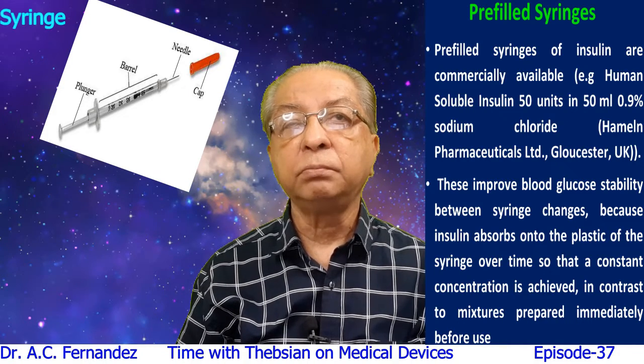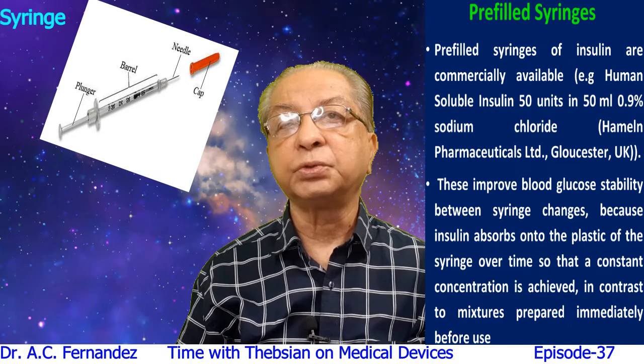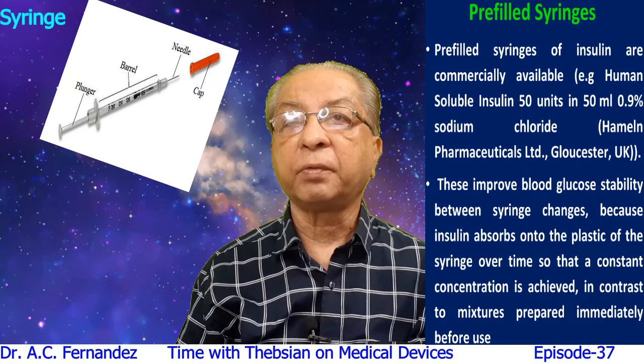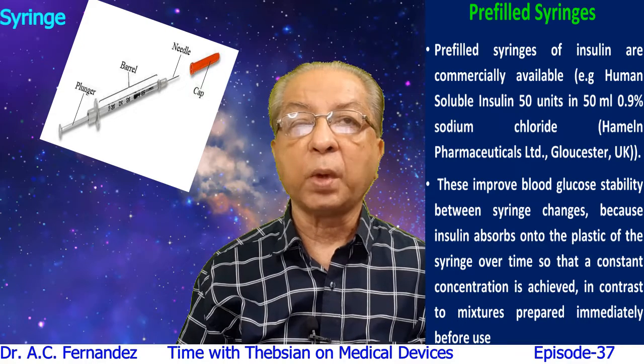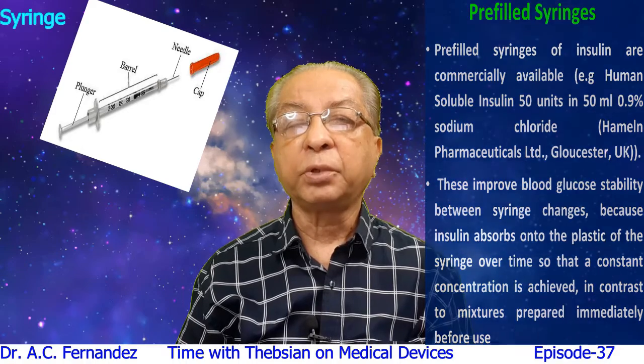The question comes up whether these syringes are safe. They are safe if they are used adhering to safe injection practices, under standard precautions to prevent disease transmission from needles, syringes or multi-dose vials. Reuse of a needle or syringe can put a patient in danger of contracting hepatitis C, hepatitis B, and possibly HIV. Use of pre-filled syringes is finding accelerated use.